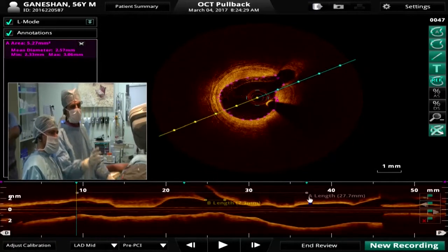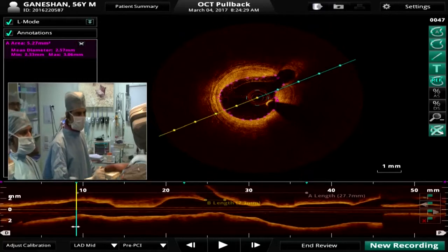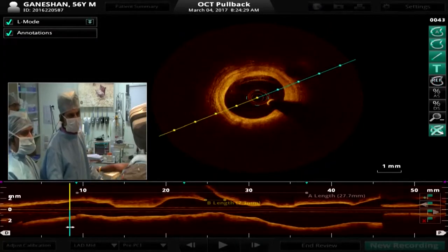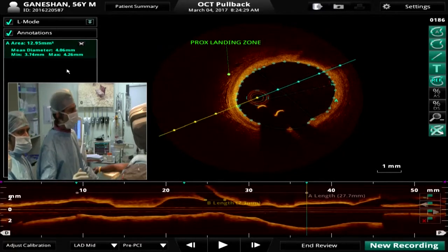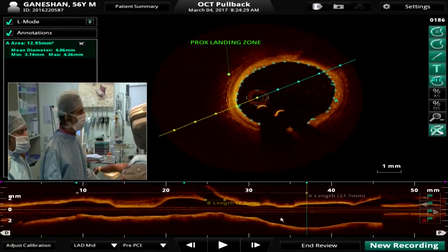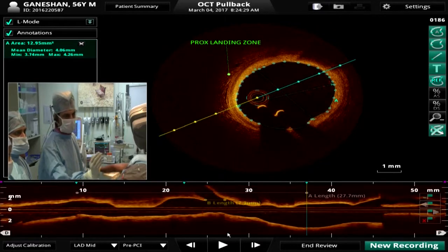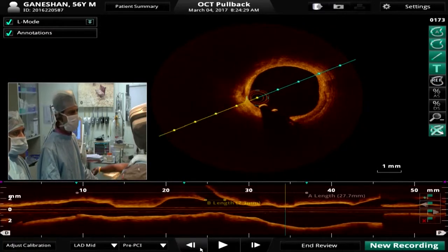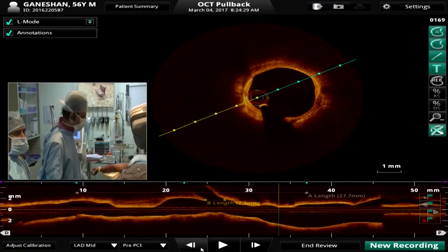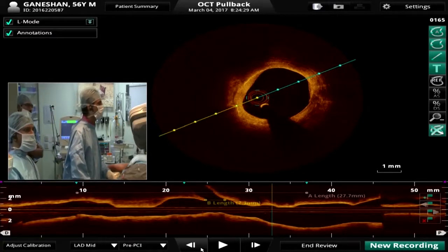Yeah, the difficulty with that is the calcification. The tightest lesion and the most difficult to expand is exactly in that area, so I guess he wants to be safe on the proximal side and have a healthy landing zone. There is a plaque also, so if he lands in a plaque, the restenosis would probably be higher. A few companies make a bottled, tapered stent. That can be a useful strategy in such a situation, but it's not available easily.